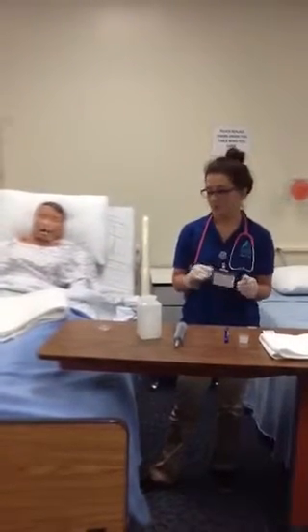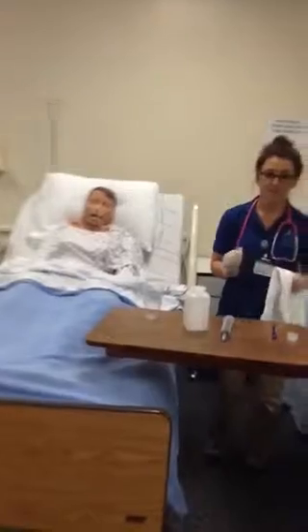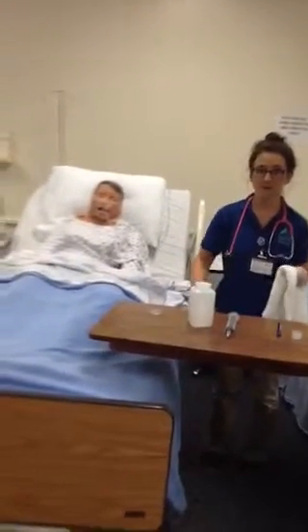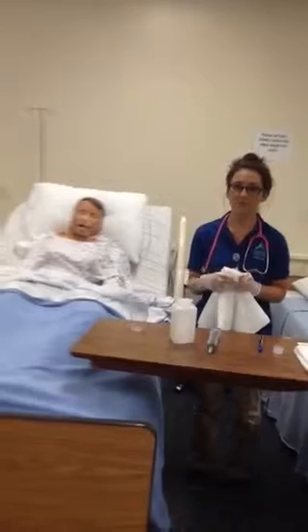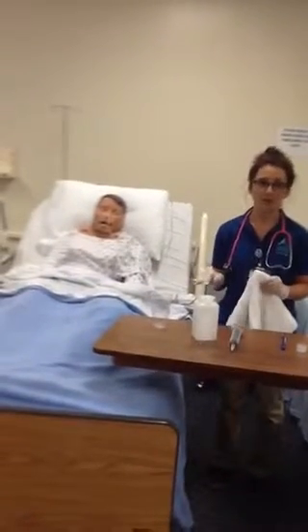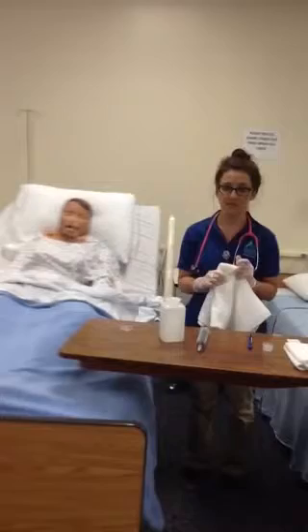Then I would also, before leaving, make sure the patient's bed is placed back to a regular level for the patient, make sure the patient's belongings are nearby, the patient doesn't need to use the restroom, just assess his pain level, and then make sure I have the call bell nearby in case he needs me. And that would conclude the insertion and irrigation of the nasogastric tube.